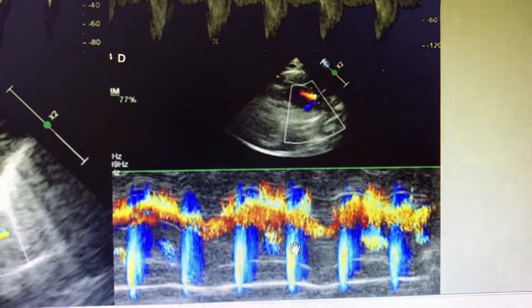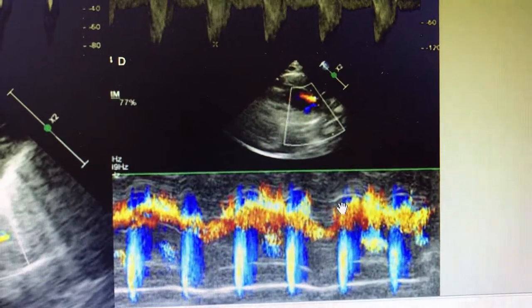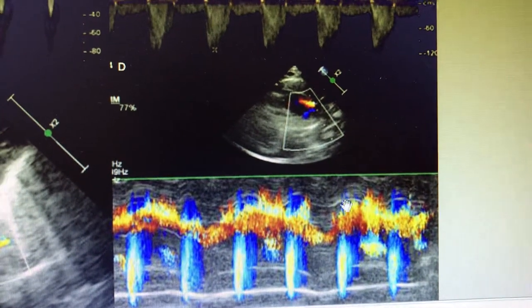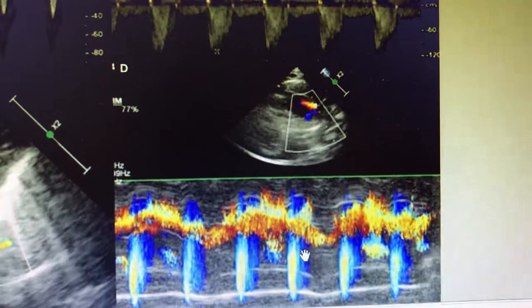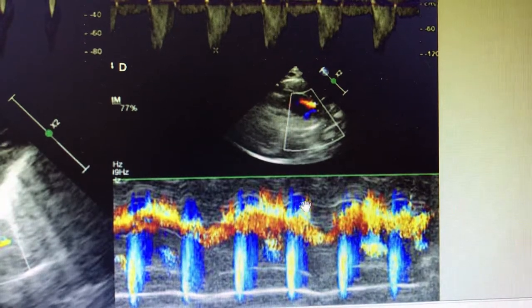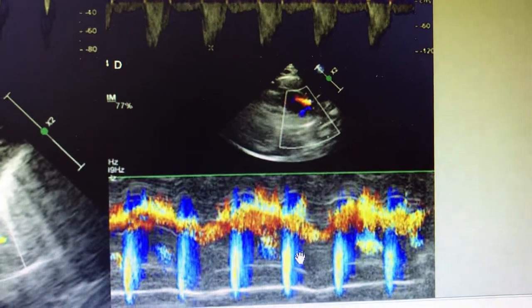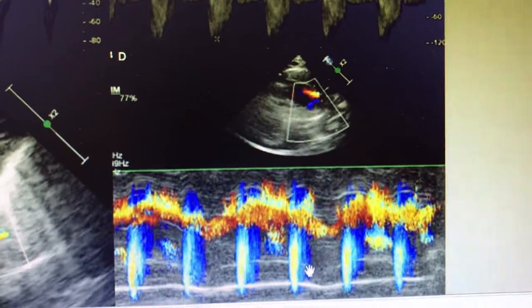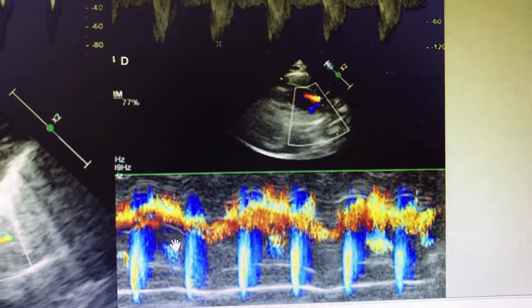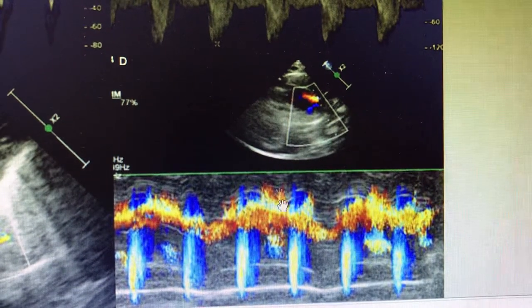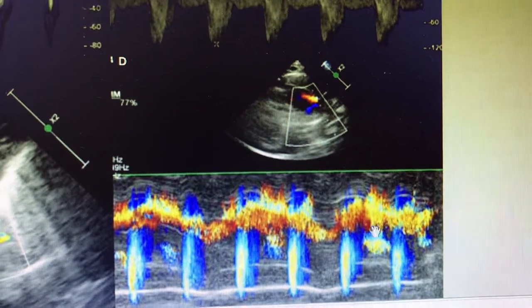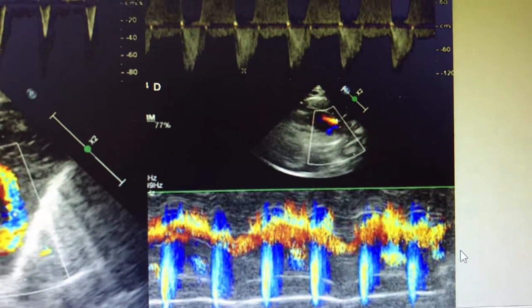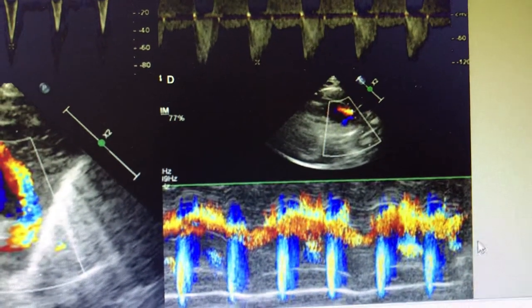This is the MO Doppler. You can see the bidirectional flow being seen most of the time. During systole there is a slight reversal of flow into the descending aorta, but most of the time it is getting into the pulmonary artery — so predominantly a left-to-right shunt.